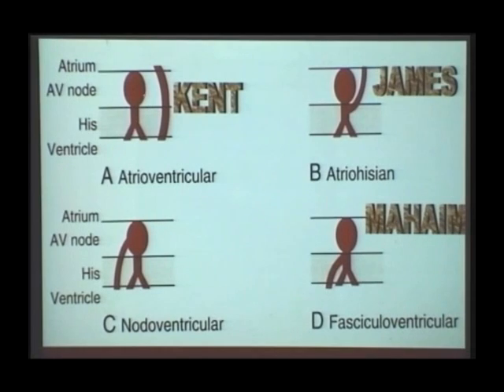Here, very importantly, because my AV node is bypassed, what will happen to my PR interval? PR interval will be short. Subsequently this accessory bundle connects to the muscle, no longer to the specialized conduction system. Although the impulse comes rapidly to the ventricle, it then conducts very slowly through the muscle. That's why you have an initial slur, which is called the delta wave.